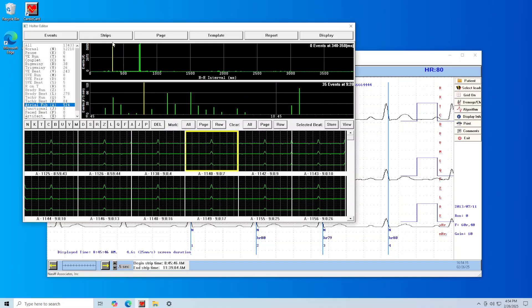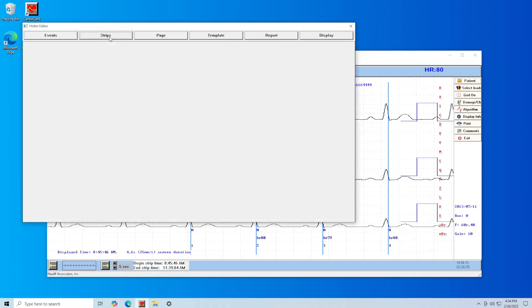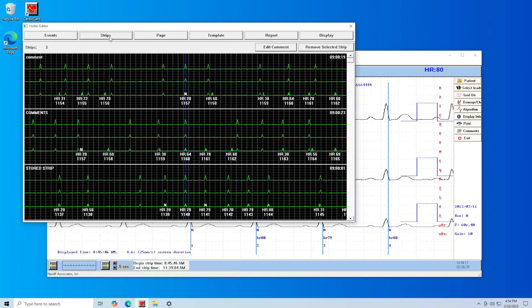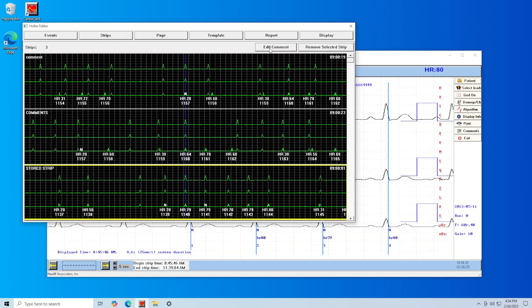Click on the Strips View at the top left. In this view, you can edit comments by single clicking on a strip and clicking on Edit Comment.